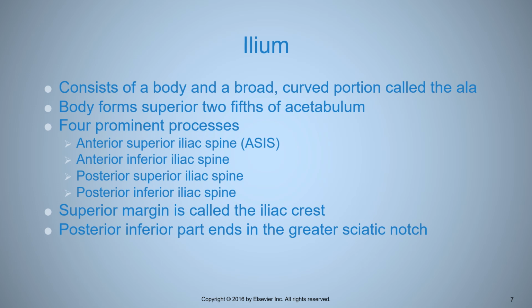Check your hand placement. Are you on the anterior side of the pelvis? Because the iliac crest is not on the anterior side of the pelvis. It's posterior and lateral.